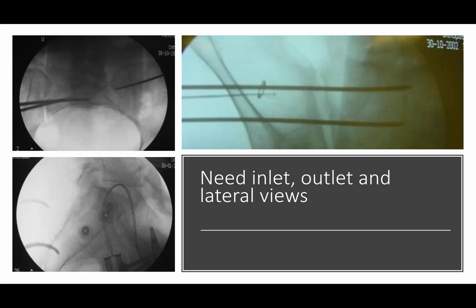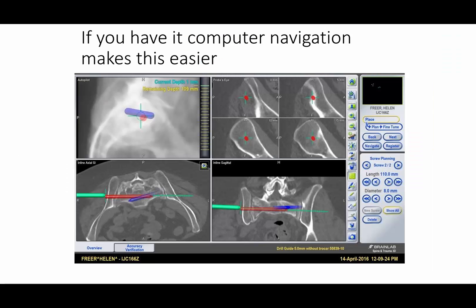That just shows what it would look like on a CT scan. Intraoperatively, you need inlet, outlet, and lateral sacral views to be able to safely do this — this is where you need good imaging. You've got to be able to see that sacral foramen, get a good assessment of the sacrum on the inlet view, and truly appreciate a good lateral image and the iliac cortical density.